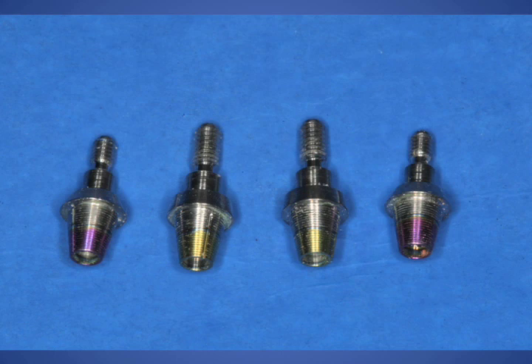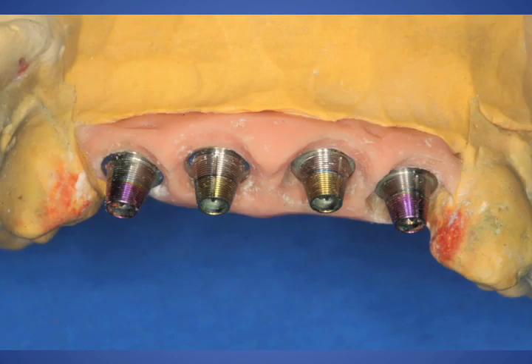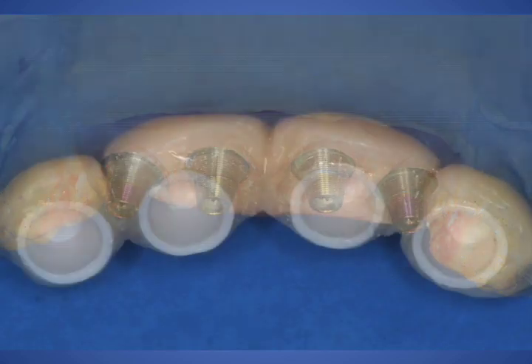We would use transitional abutments in this situation. You can see they're conical in shape, which would allow us to place our final transitional splinted crowns the day of surgery. So these are transitional Nobel BioCare abutments that, again, are all done preoperatively by the dental laboratory. They are determining ideal position for ideal final aesthetics of the final crowns.